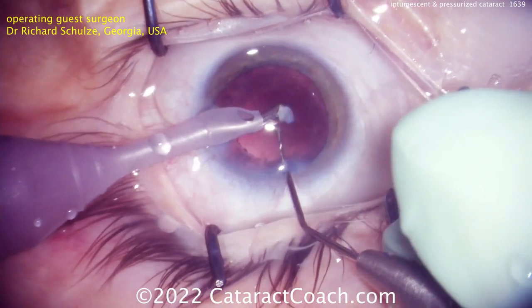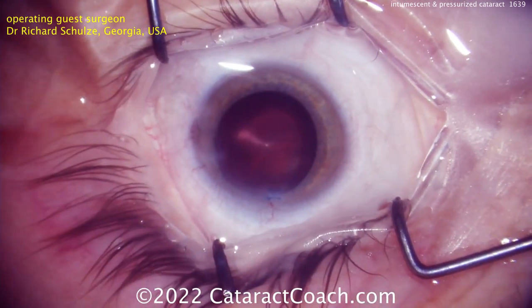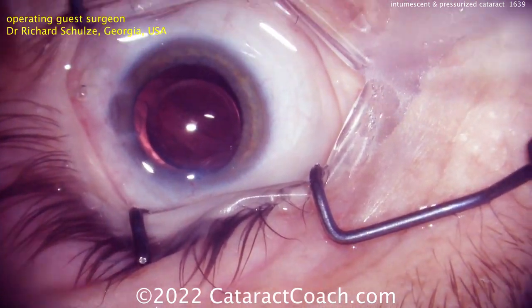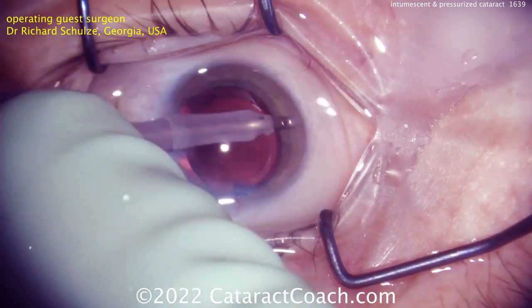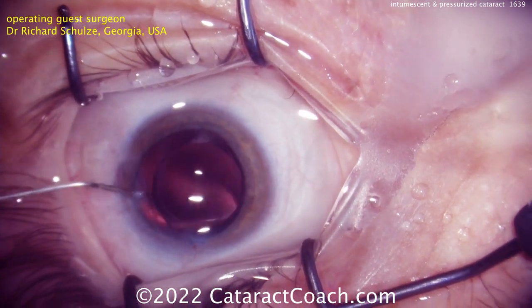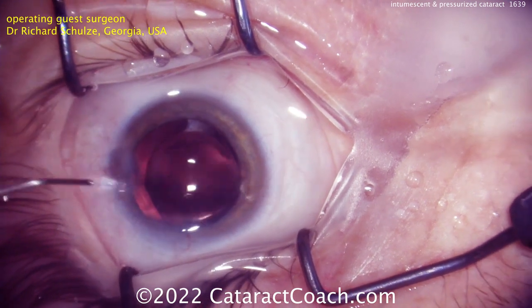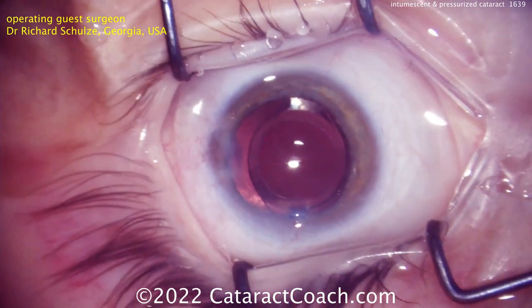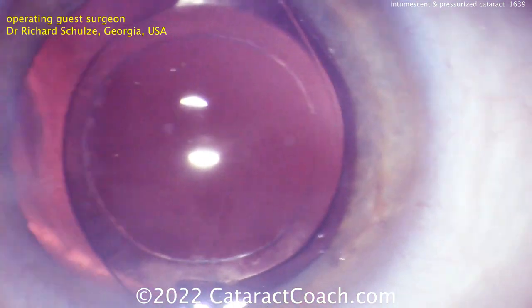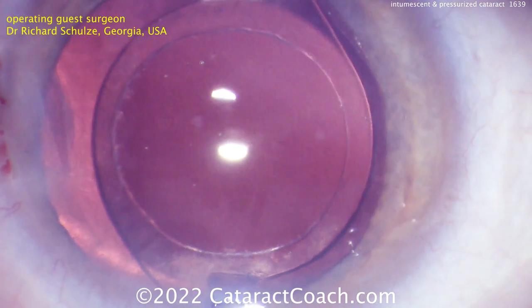The video is sped up for the quick removal. What's important to show at the end is when the lens goes in the eye — how beautifully centered it is and how you have a great 360-degree overlap of the optic by the capsulotomy. The lens is being delivered quite nicely, with very little cortex in this eye. Viscoelastic is removed and any residual cortex cleaned up. Zooming in at the end: the centration is really quite beautiful. The 5.2-millimeter capsular opening beautifully overlaps the 6-millimeter optic, holding it perfectly in position.